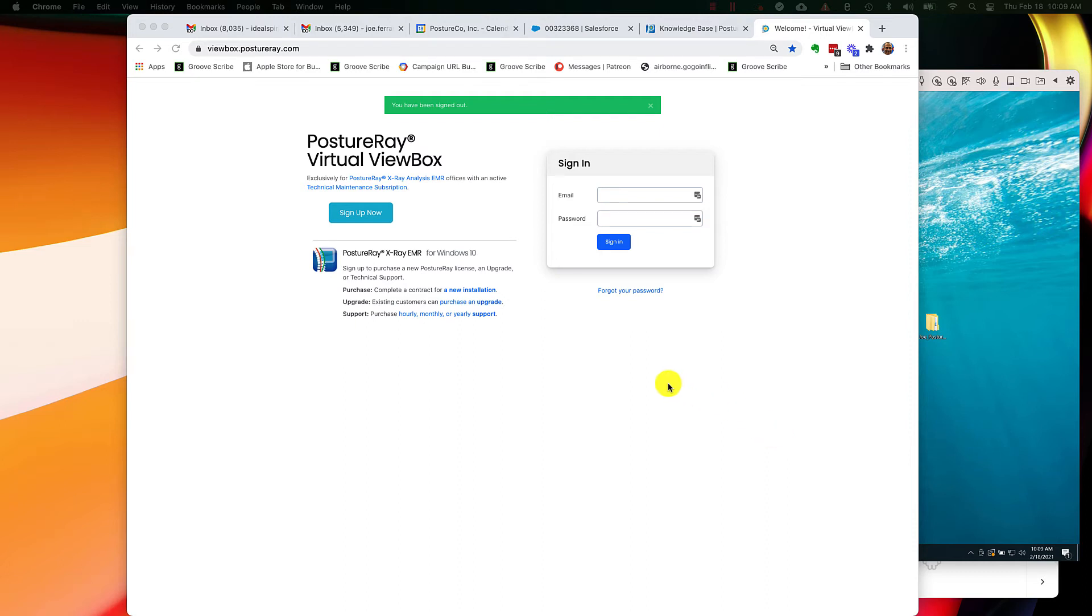Hello, in this tutorial we're going to show you how to reset your password on the Virtual ViewBox for Posture X-Ray EMR System.